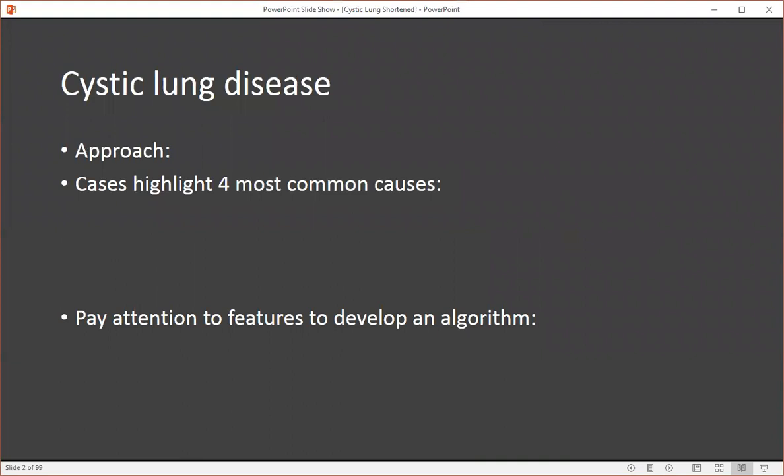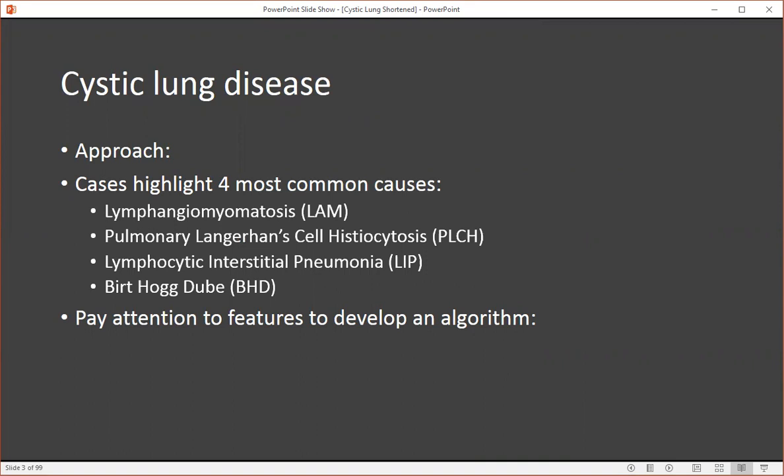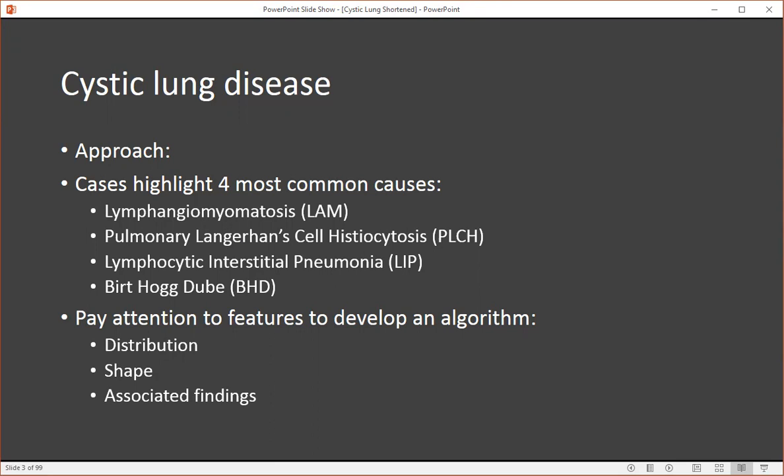Our approach is going to use cases to highlight the four most common causes: lymphangiomyomatosis, pulmonary Langerhans cell histiocytosis, lymphocytic interstitial pneumonia, and Birt-Hogg-Dubé. While we go through these cases, it's important to pay attention to the distribution, shape, and associated findings of these cystic lung diseases to help develop an algorithm at the last part of the lecture.